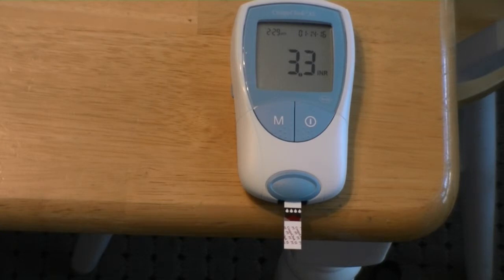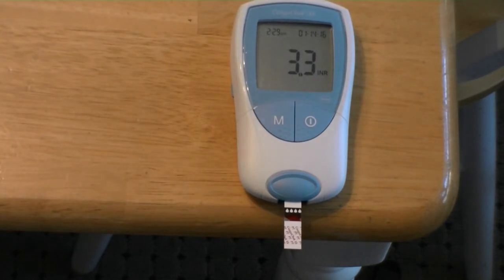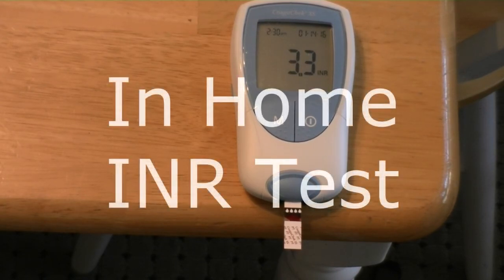Now I have to transfer that into my booklet here, which keeps track of all my information. Then I have to call in to a phone number, enter a PIN number, and report my INR, which is then given to my doctor either later today or first thing tomorrow. He'll know where I'm at, and if the number was high or low it would tell him I was having some sort of an issue and he would call me and tell me I needed to adjust my levels of Warfarin. And that's basically how you do an INR test at home.